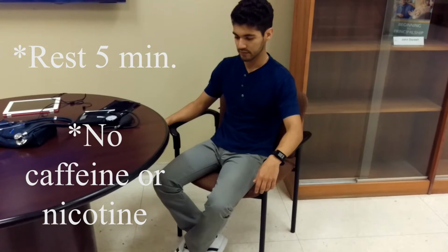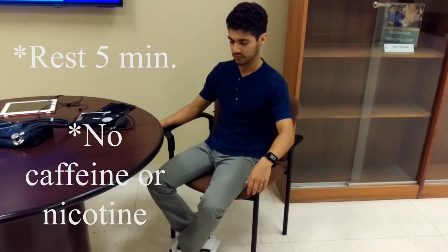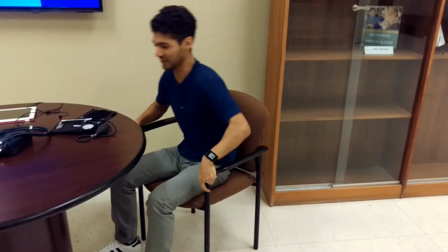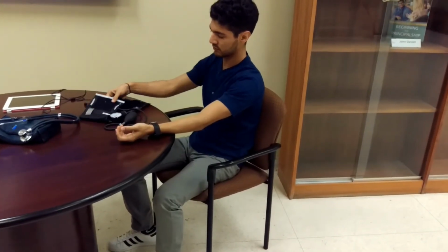Pre-assessment phase. Patient must rest for at least 5 minutes. Patient must not consume any caffeine or nicotine at least 30 minutes prior to assessment. Taken over bare arm, no jacket or sleeve. Back supported against the chair. Feet on floor, uncrossed. Arm must be elevated at heart level, and proper cuff size must be used.